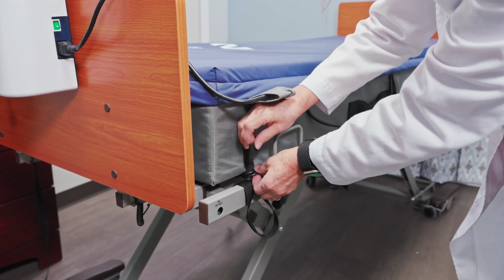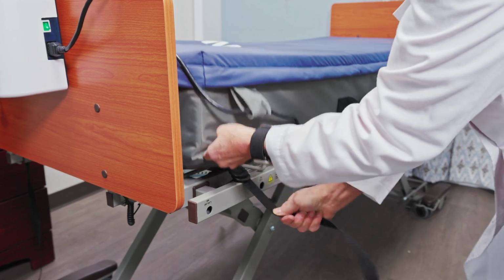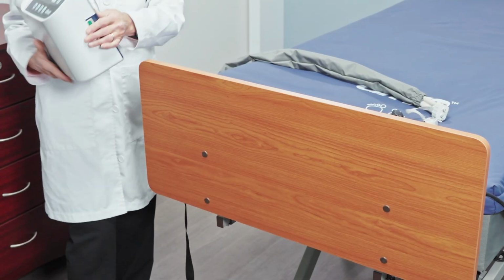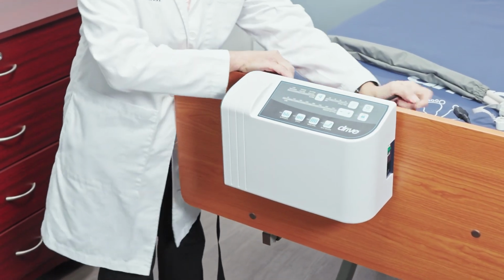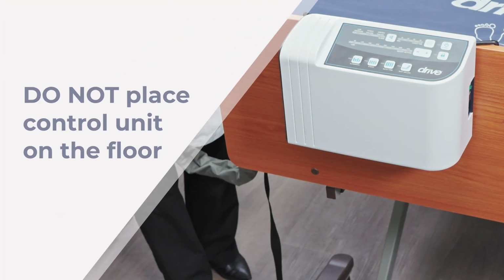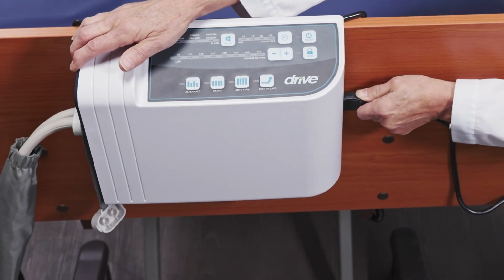Secure the mattress firmly to the bed frame by fixing all 6 straps and ensuring the moving and articulating sections of the bed are still free to move. Next, hang the control unit onto the bed footboard and adjust the hangers to the best upright position of the control unit. Do not place the control unit on the floor. Push the power cord into the power socket and plug it in.